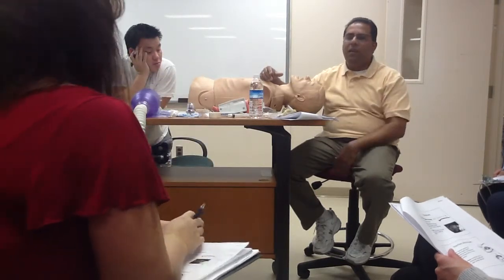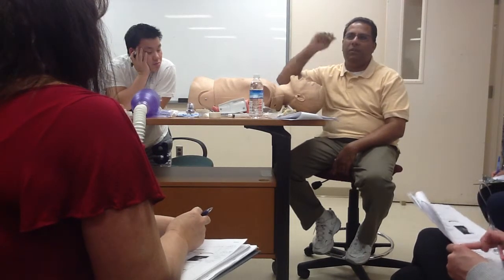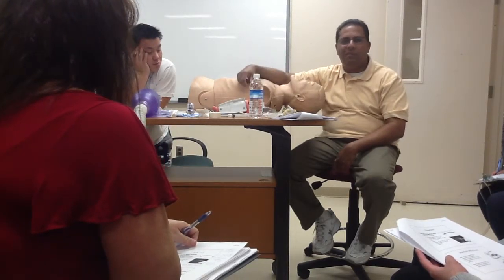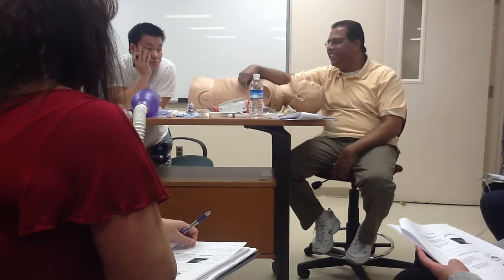How about some kind of nasal septal defect? If you have a right nasal septal defect, what are you going to do? He's trying to put it in, it won't go down. Use the other one. And if he can't do the other side, what are you going to do? Who wants to try it? Find another one. Nothing you can do. Keep moving.